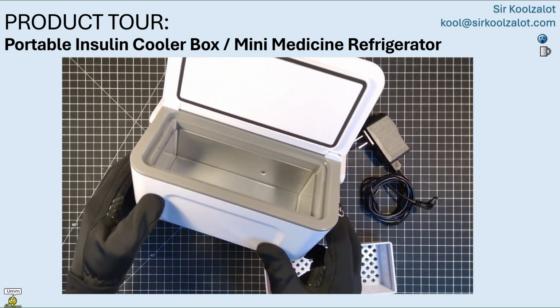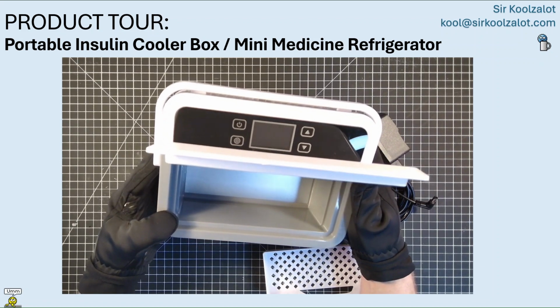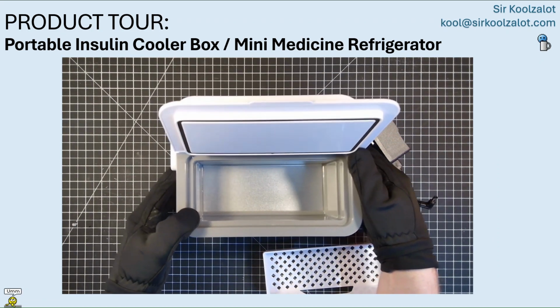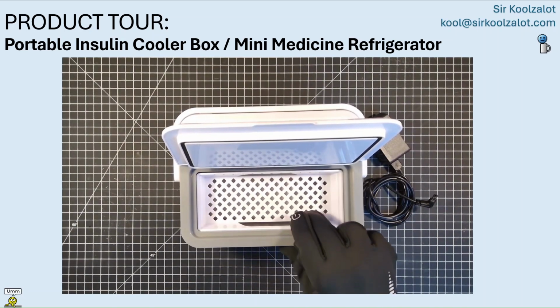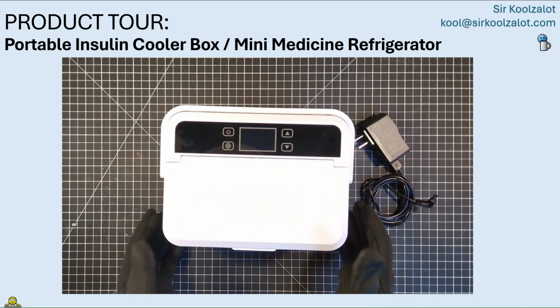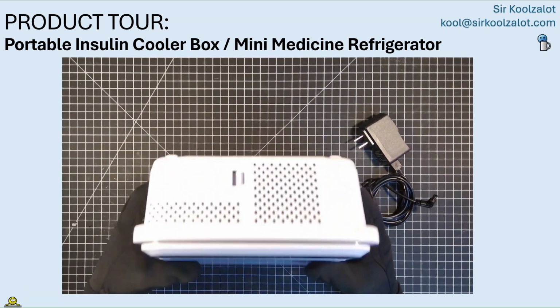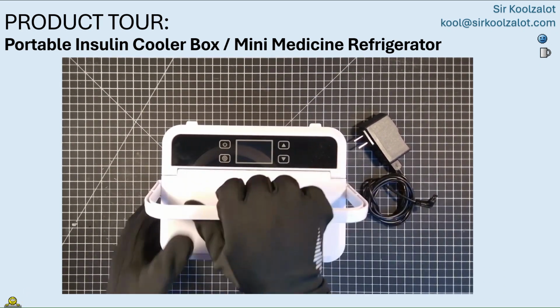When you angle it to the side, you can see the inside of the container, and there's a little screw that you might notice there on one of the back plates. Make note of that. That back plate is the plate that provides the cooling to the container. The rest of the walls do not provide cooling. They're more just part of the container. But that back plate there that you saw earlier with the screw in it is the one that actually gets quite cool.